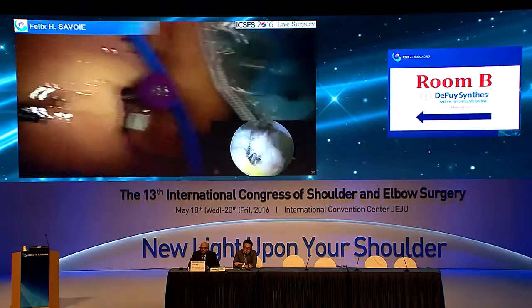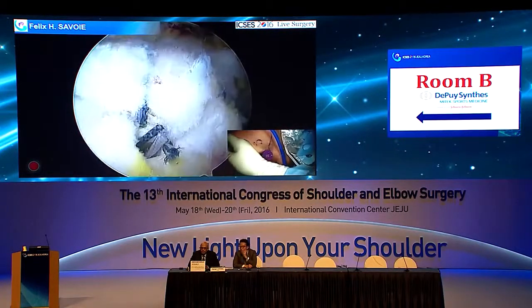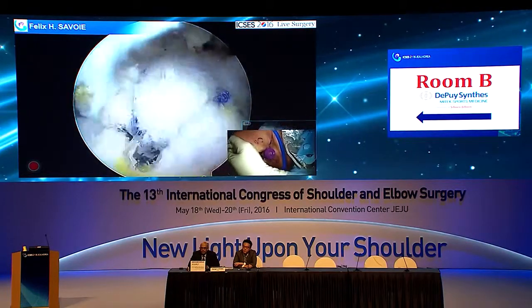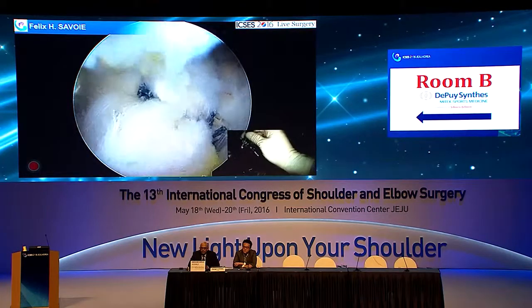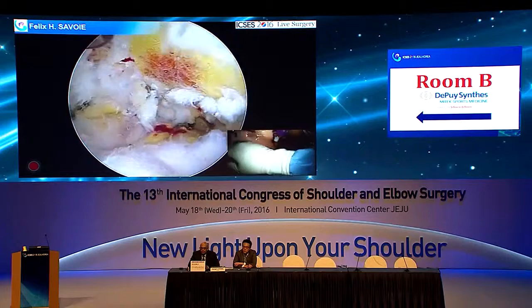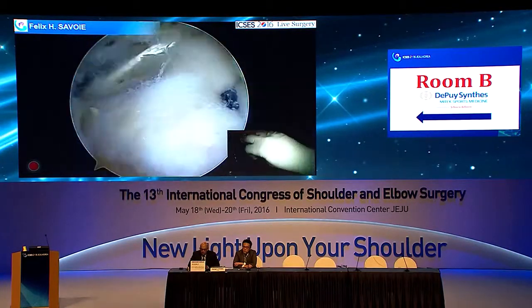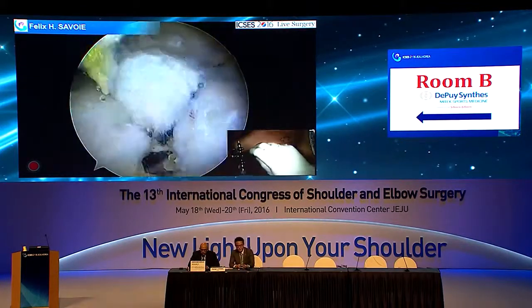Okay. And then now we'll take a look at our cuff. So here's our rotator cuff. We can move it back and forth. It does very well. It's not bunching up. There's no undue tension. You can adduct it and abduct it to make sure it moves. There's no more lateral impingement to cause a problem. We don't have to do anything with the AC joint. We've released our coracohumeral. There's our conjoint tendon. And so then we're done.